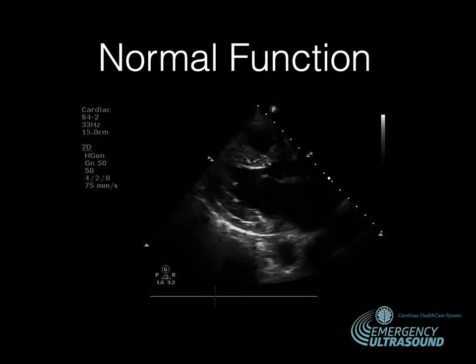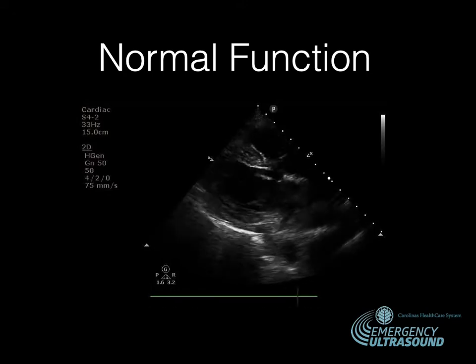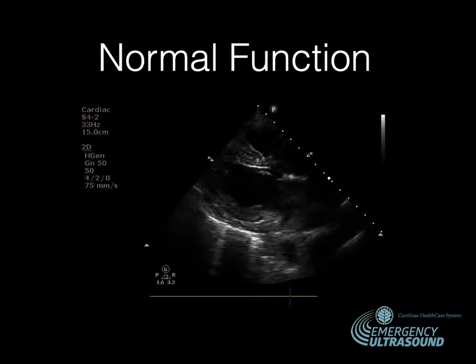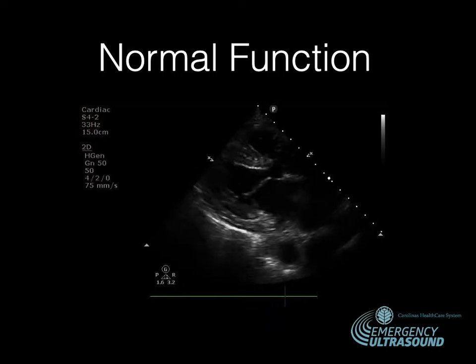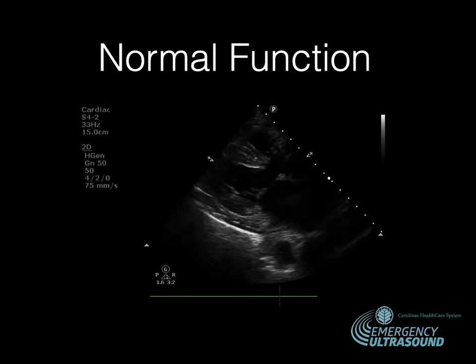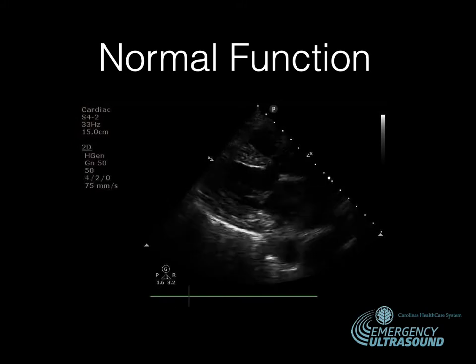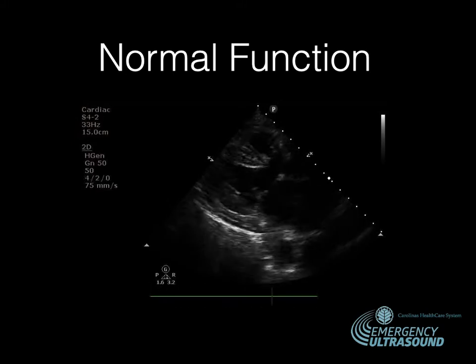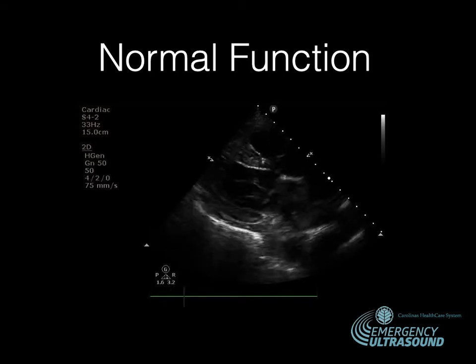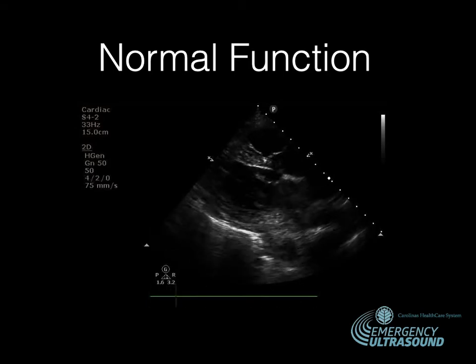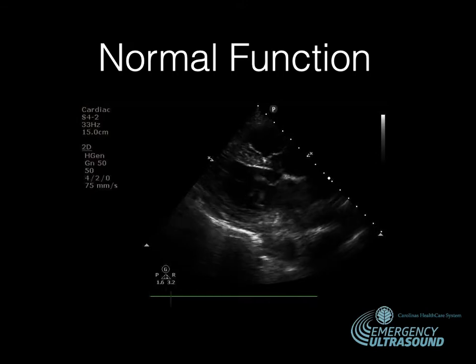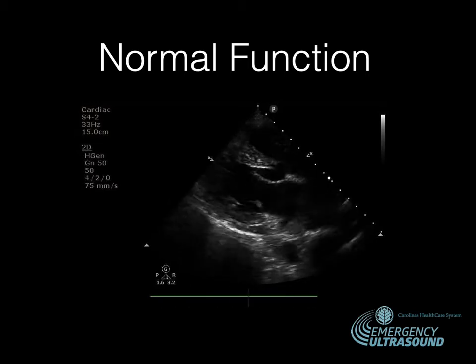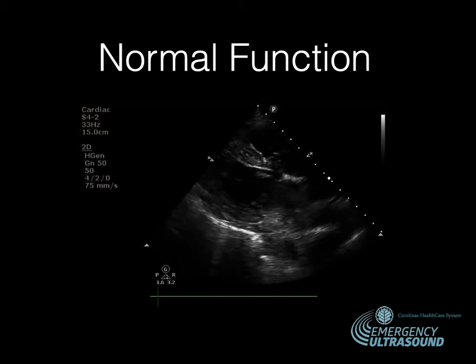Here we see a totally normal functioning heart in the parasternal long axis. We look first at the E-point septal separation. The anterior leaflet of the mitral valve — its tip should come up and really hit the interventricular septum, opening and closing with each beat. When heart function decreases or heart failure develops, that valve doesn't come all the way up to the interventricular septum. We can measure this using M-mode; an E-point septal separation of seven millimeters or greater is associated with poor function.